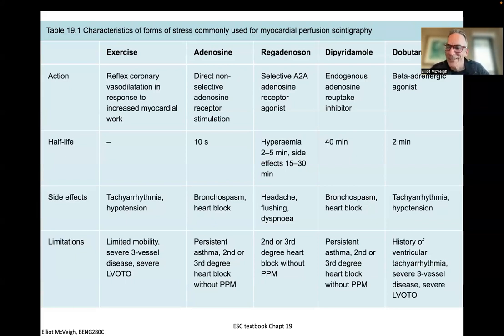Because the only thing that's really cranking is their heart. Their legs and everything else don't have oxygen demands. And so they can quietly lie in the scanner with this really cranking heart, and you can take pictures. And this is used often to do real-time stress testing with echocardiography.